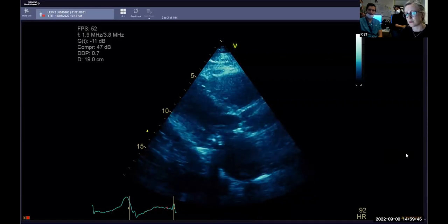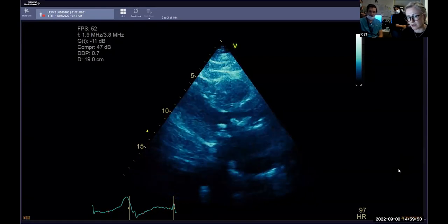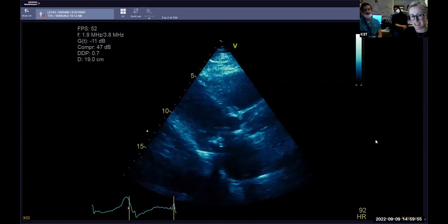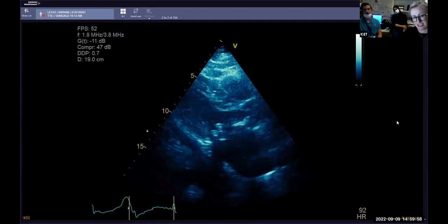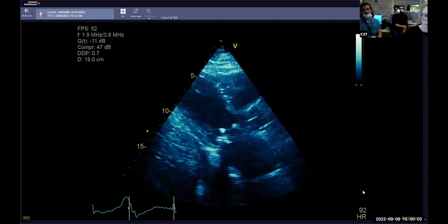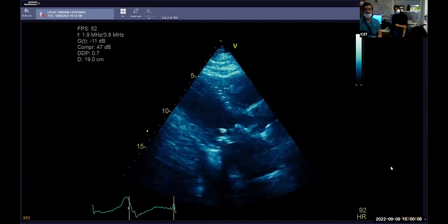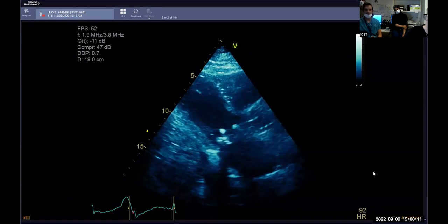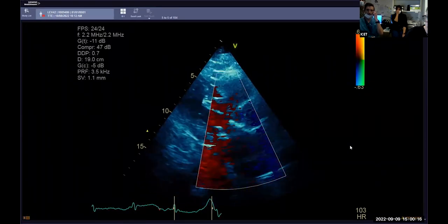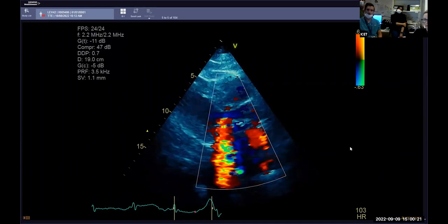What do you think of the prosthetic mitral valve in terms of what type of valve and how it's functioning, as much as you can see? Again, it's quite difficult to see. You can see that there are two struts there. One of them is, as always, relatively close to the LV outflow tract, so I'd want to interrogate some color Doppler over that, particularly with the hyperdynamic function. There's quite a lot of hyperechoic material next to that. There is a strut there which I want to look at more.